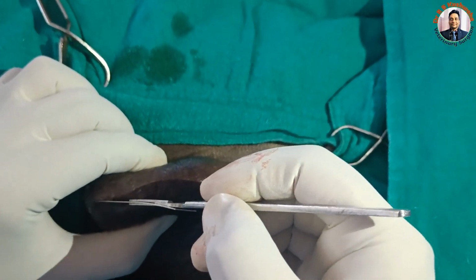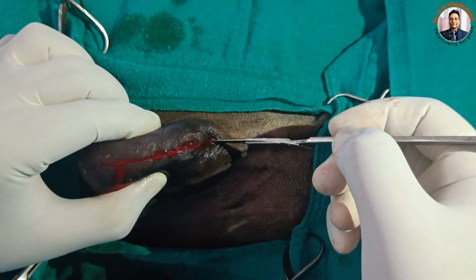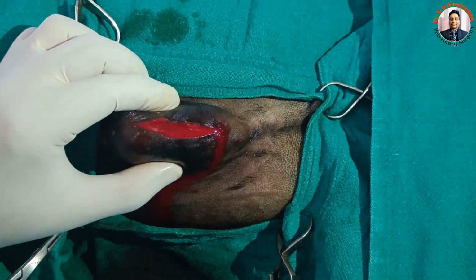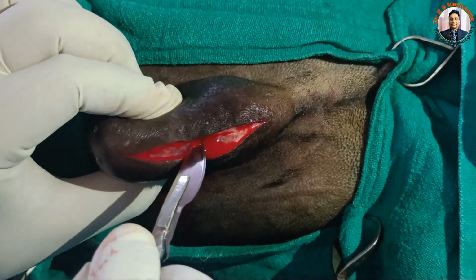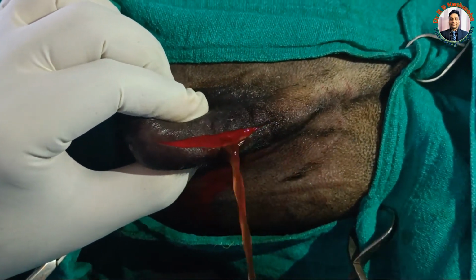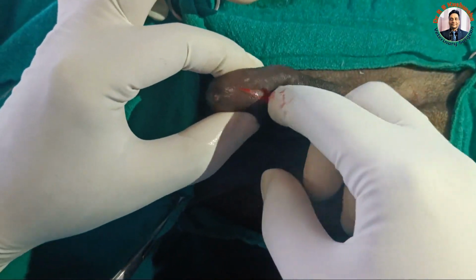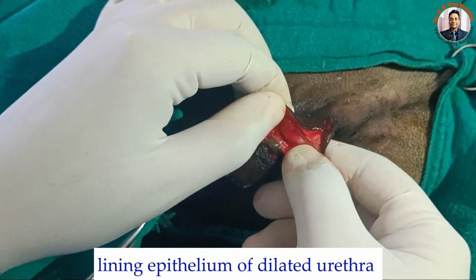The moment I make the incision, first I will try to make the incision over the skin only, not cut the urethra. Then I will prick in the center. Urine will definitely come the moment I prick here. So now you could see this area has collapsed. Definitely when we open, you will find the lining epithelium here.